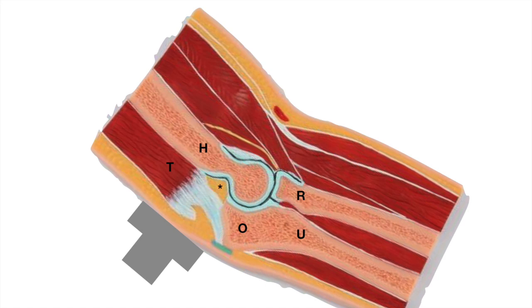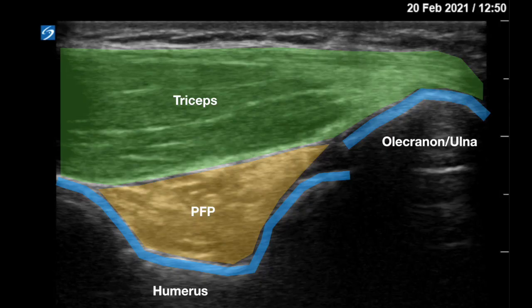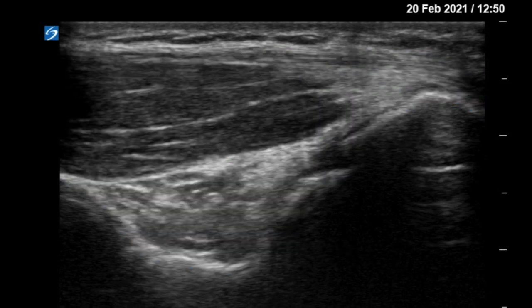Deep to the skin and subcutaneous layer, you'll see the triceps in long axis connected to the olecranon process of the ulna, and just deep to that you'll see the fat pad, which lies in the groove in the posterior humerus called the olecranon fossa. On ultrasound you can see the triceps in long axis with all fibers connected to the olecranon process, with the posterior fat pad mostly lying within the olecranon fossa and no fluid elevating it.